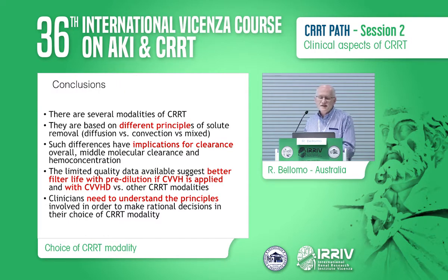So let me conclude by saying that there are several modalities of CRRT. They are based on different principles of solute removal, diffusion or convection, or a mixture of the two. These differences, as I hope I have clarified for you, have implications for clearance and efficiency overall, and comparing convection to diffusion for middle molecules, and comparing pre-dilution to post-dilution for hemoconcentration.